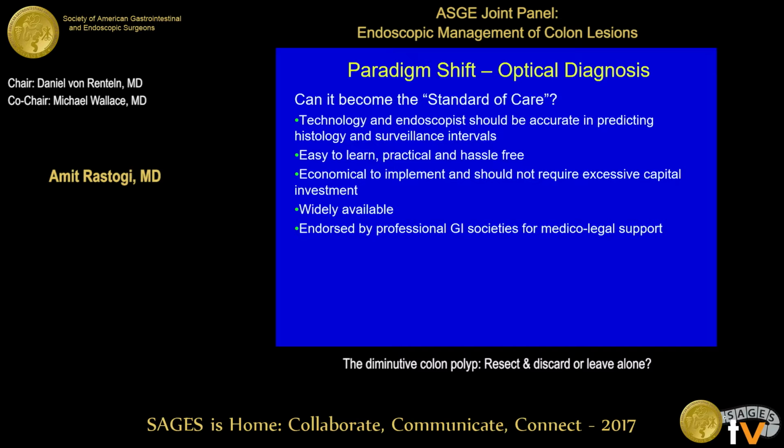So this paradigm shift has been discussed for a while now. A lot of studies have been done. Can it become standard of care? Till now, we are still resecting all these polyps and sending them to pathology. I mean, there are several things that have to be accomplished before it can become standard of care. The technology and the endoscopist has to be accurate in predicting the histology as well as the surveillance intervals.